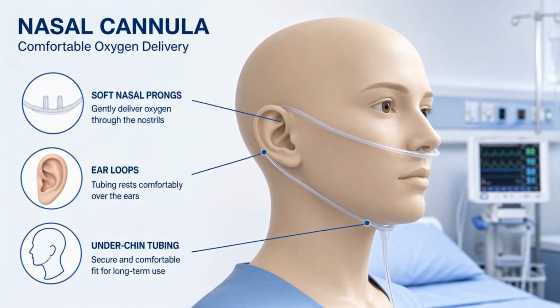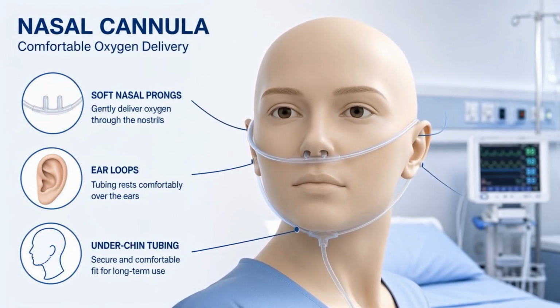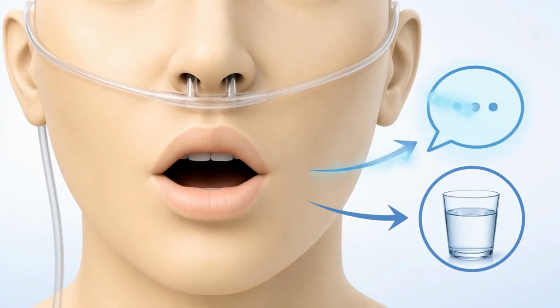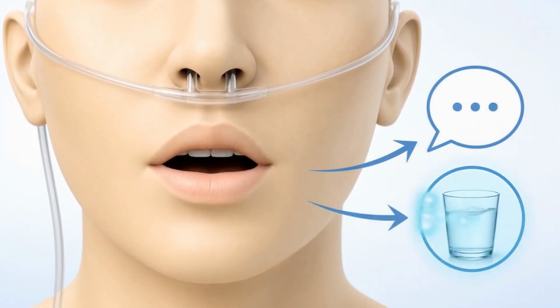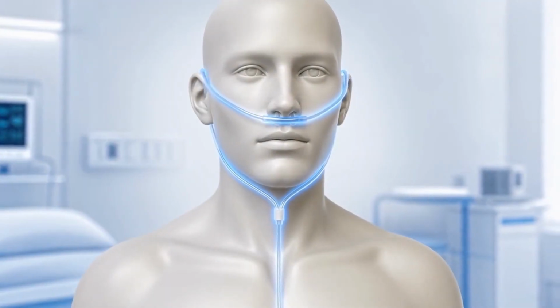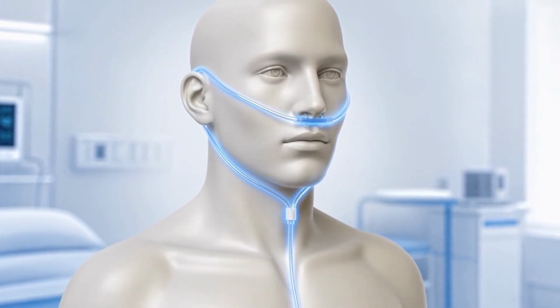Patients typically tolerate the cannula well because it is lightweight and comfortable for long-term use in a clinical setting. Crucially, this device allows the patient to eat, drink, and speak without significant obstruction, improving their overall comfort levels. It is the standard choice for patients experiencing mild respiratory distress or those with low oxygen saturation levels needing support.